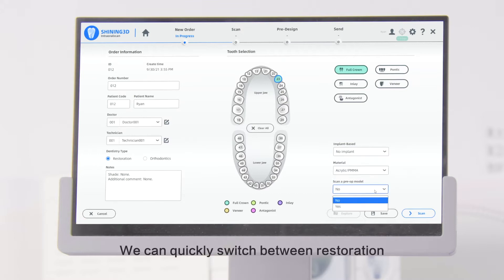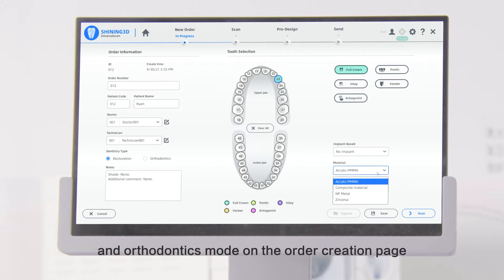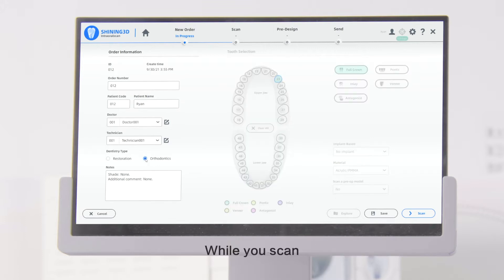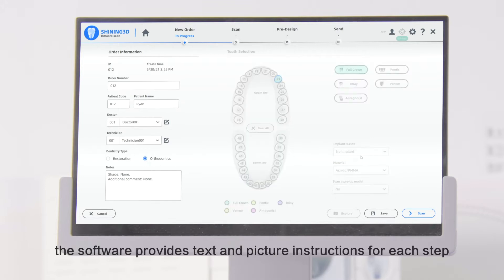We can quickly switch between Restoration and Orthodontics mode on the Order Creation page. While you scan, the software provides text and picture instructions for each step.